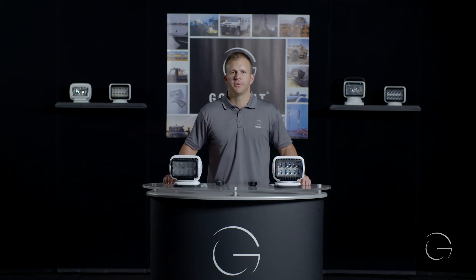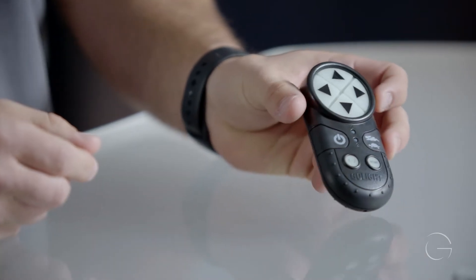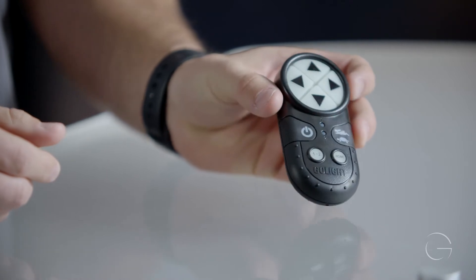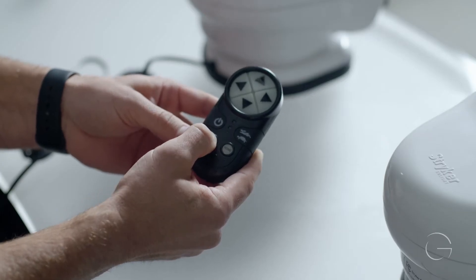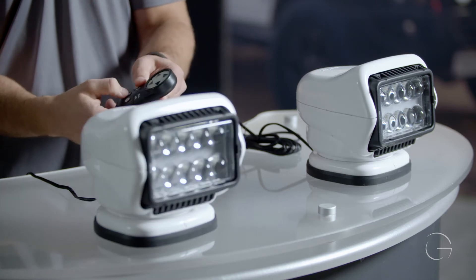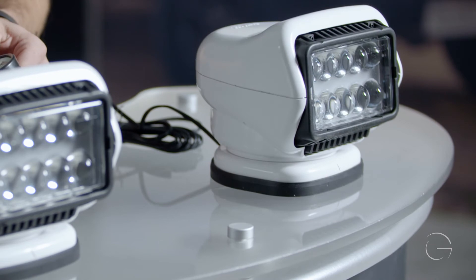In this video we'll be doing the duplication process for the Stryker ST wireless remote. Once you have successfully paired your Stryker ST remote to either one or two Stryker ST lights, you can then duplicate additional remotes.